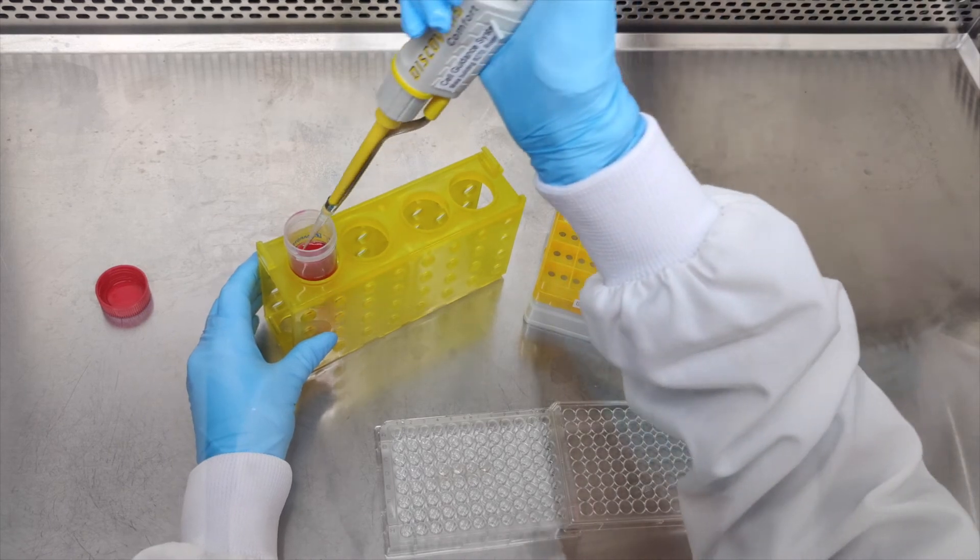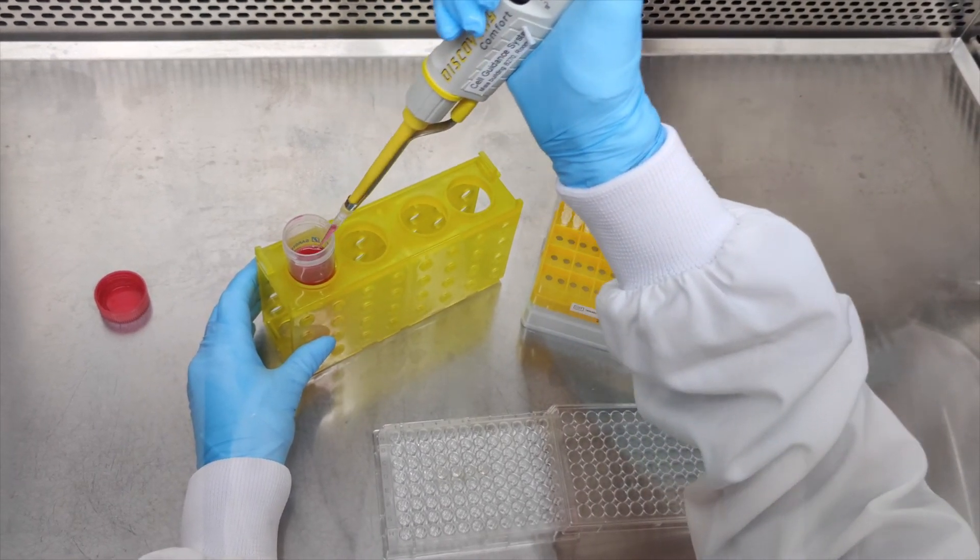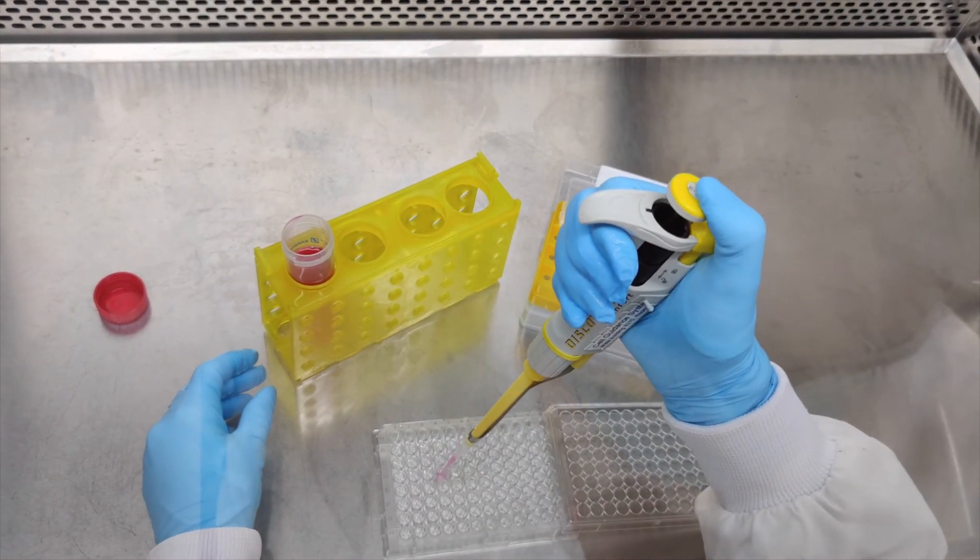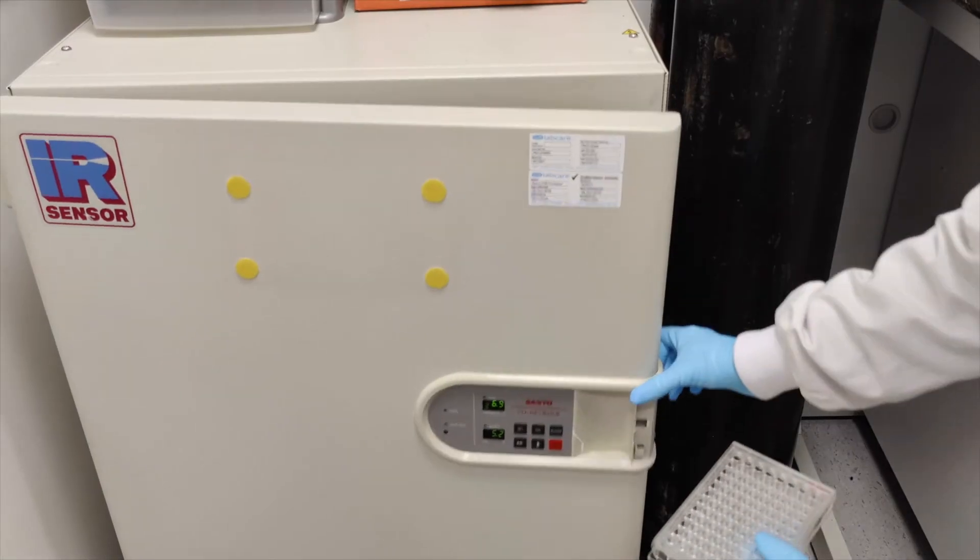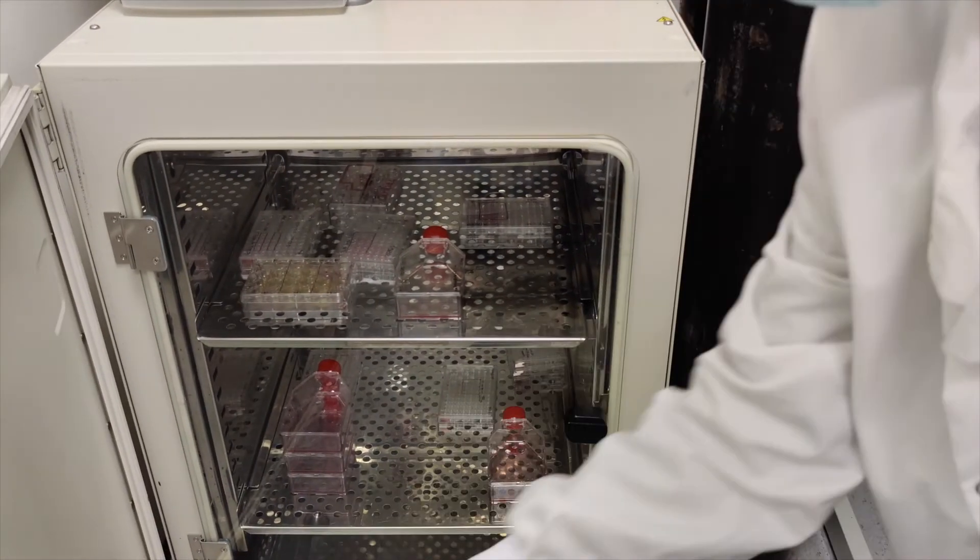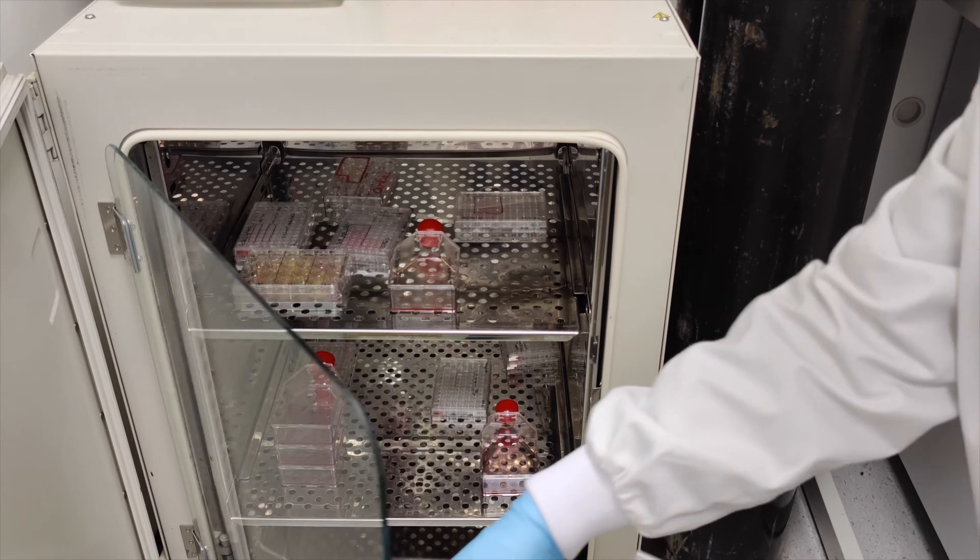Add enough cell culture media to each well to cover the peptagel. Place the well plate in the incubator at 37 degrees Celsius.